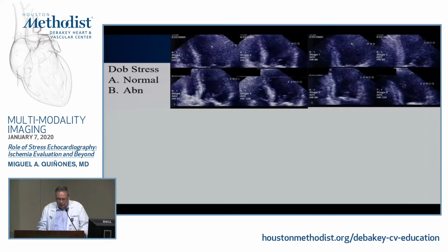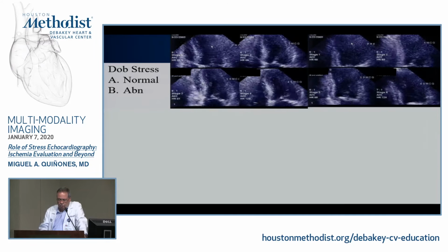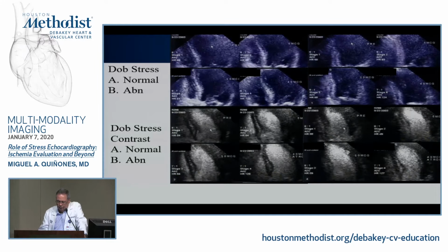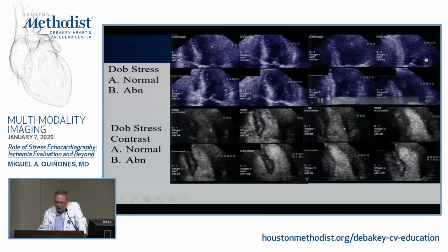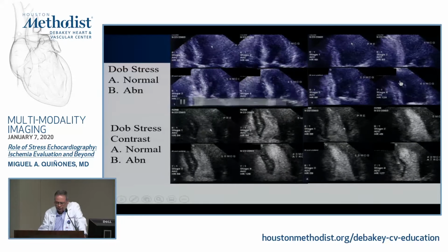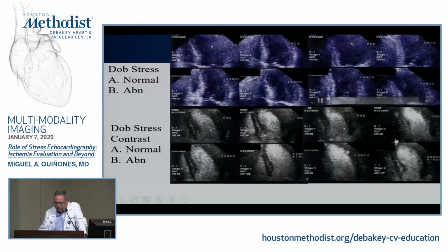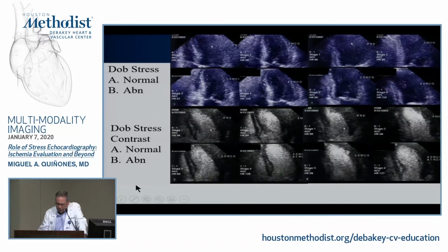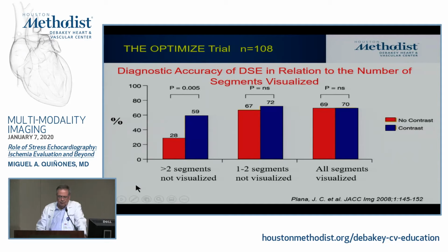All right. This is just to bring up the fact that contrast is very helpful. Without contrast, we could maybe be a little worried here, but to be honest, this would have been a worthless test without contrast. And this is the same one you saw earlier where we had a very prominent abnormality at the apex. So contrast is like turning the lights on.